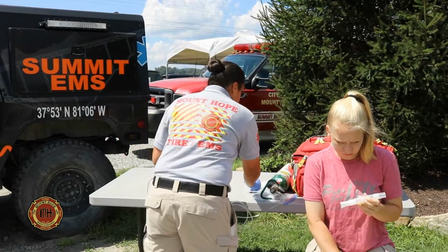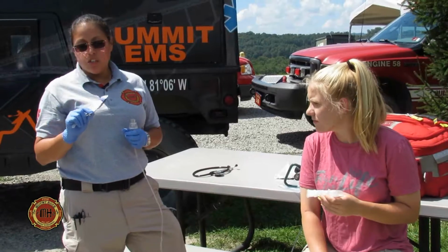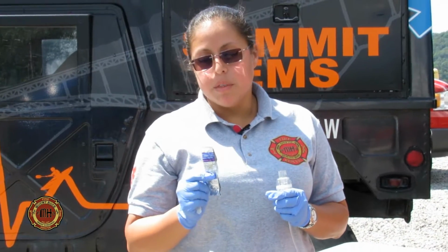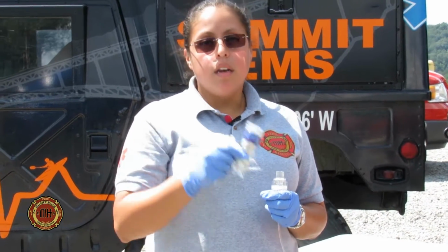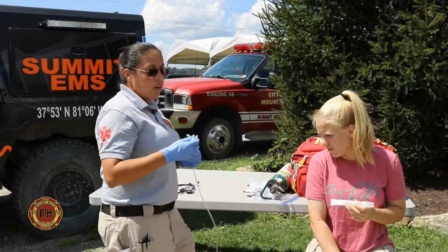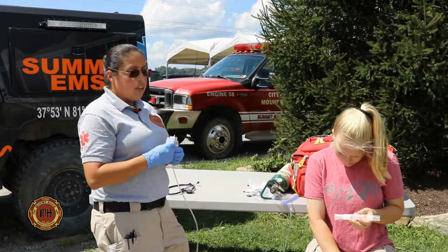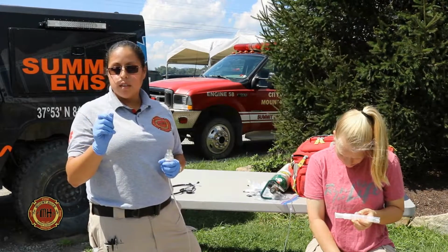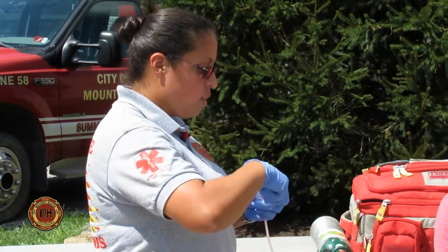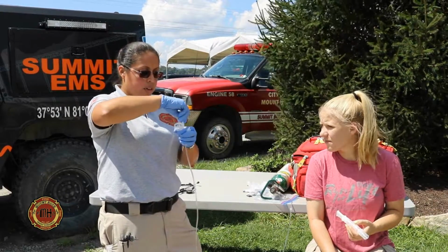We want to put our medication in. So the duonebs, they come as a package together. This one just has the 0.5 milligrams and the 2.5 milligrams of albuterol. So you will need another albuterol to make it that full 5. So you can use this, or you can use 2 of your regular 2.5 milligrams of albuterol and then your 0.5 of Atrovent, and all 3 of these tubes will make your duoneb. And so what you'll do is you'll open your containers and you'll squeeze them into the chamber.